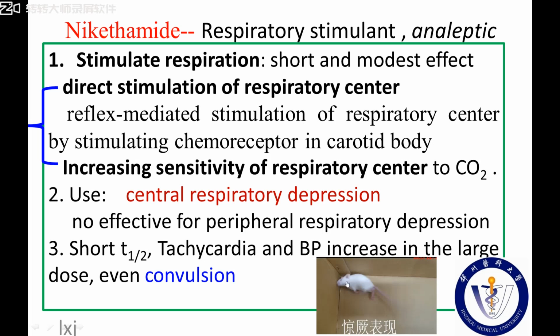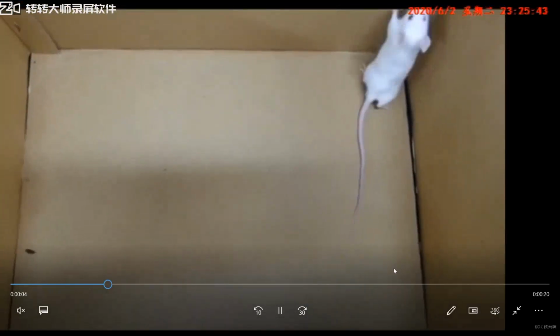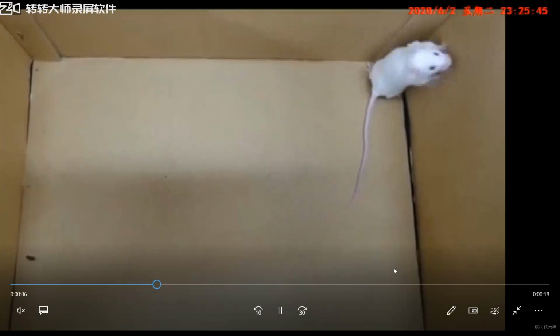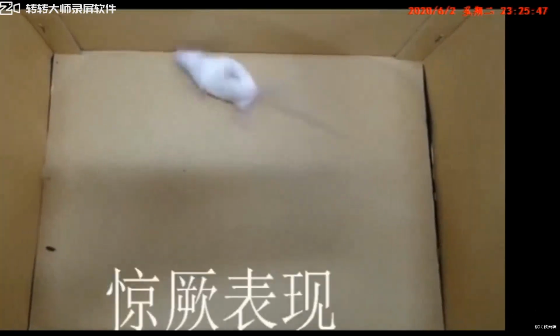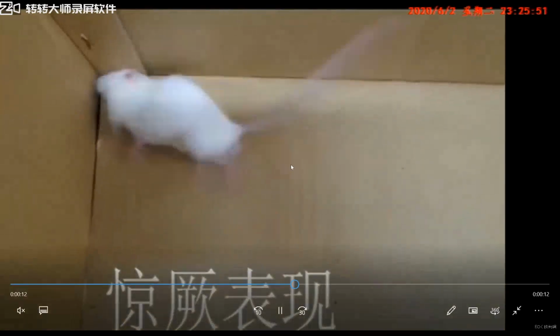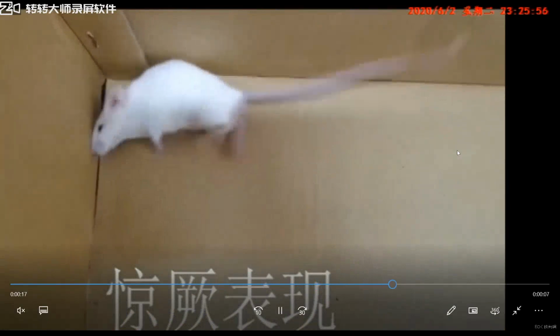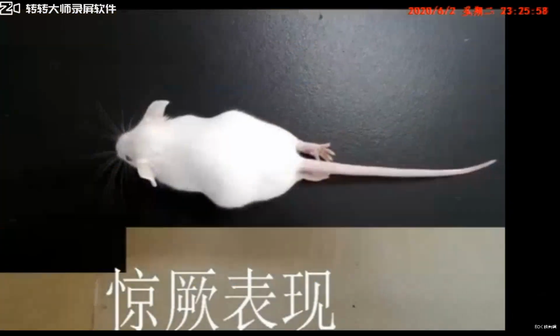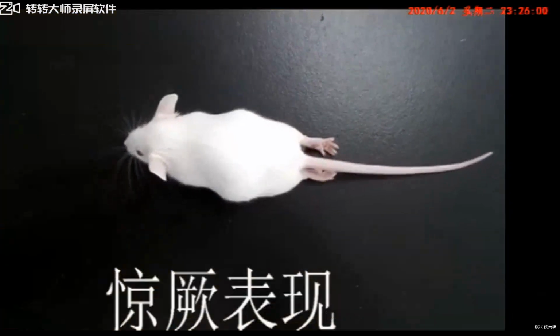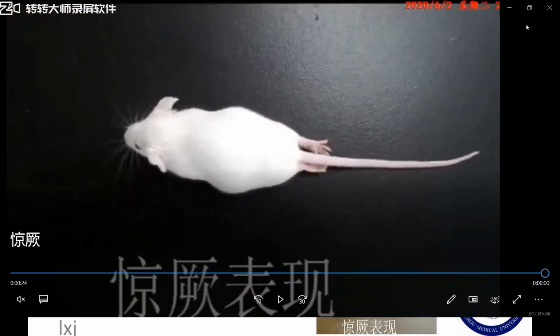Now, please watch this video to show you convulsion on a mouse. This is normal condition. Now, every piece of muscle over-contracts. This is convulsion, caused by over-excitement of the CNS. And then, over-stimulation of the CNS finally can convert into depression, even death.